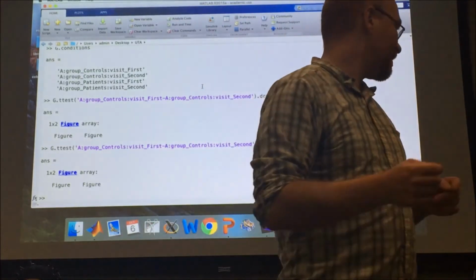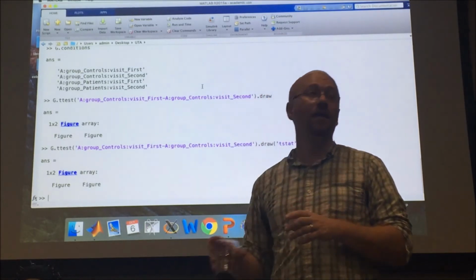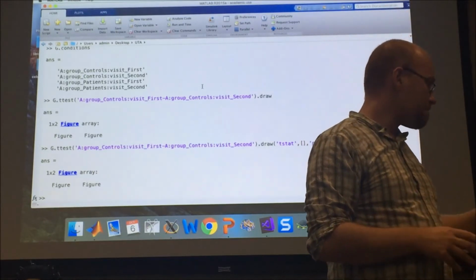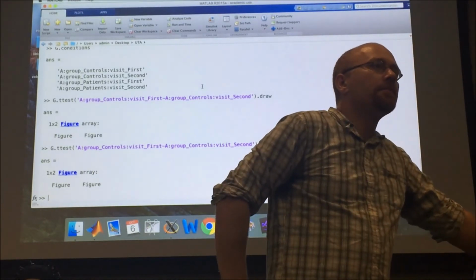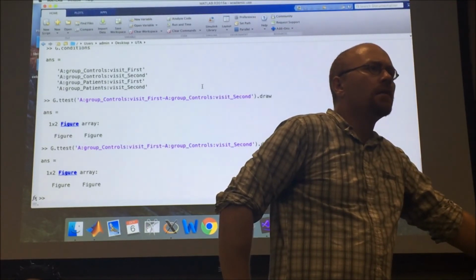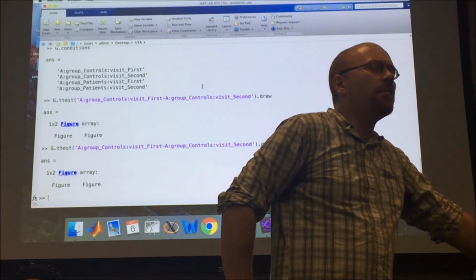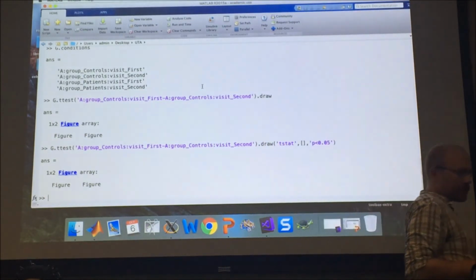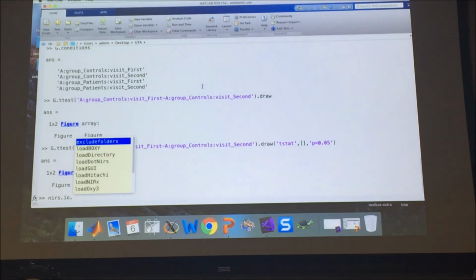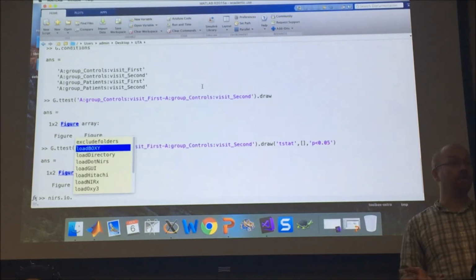You were next. If you have, say, an arbitrary setup of channels, what does that data structure need to look like to be fed in? Could it mimic what the NIRx machine puts out? My toolbox inputs are all in NIRS.io. I have one for Boxy, which is the ISS, and the .nirs format, which is the Homer version. So if you can get your data into a Homer version, I can use it.